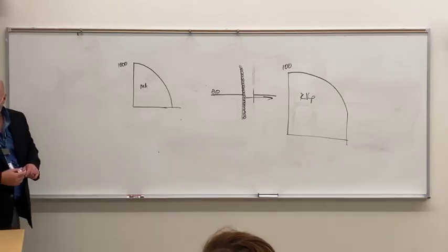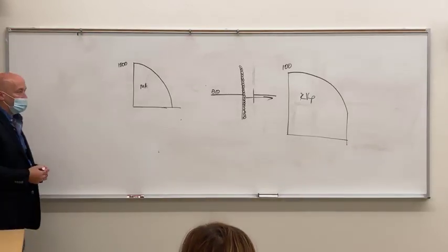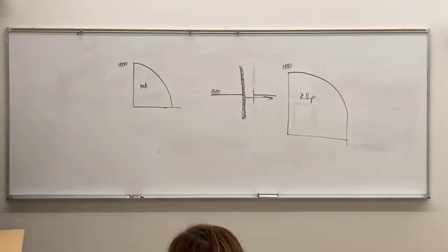Voltage ripple we talked about, so I won't go back through that. The chart on page 99, figure 5-29, kind of runs through all that. And really the only other thing is power rating. You know how to calculate power. Power is voltage times amperage, right?